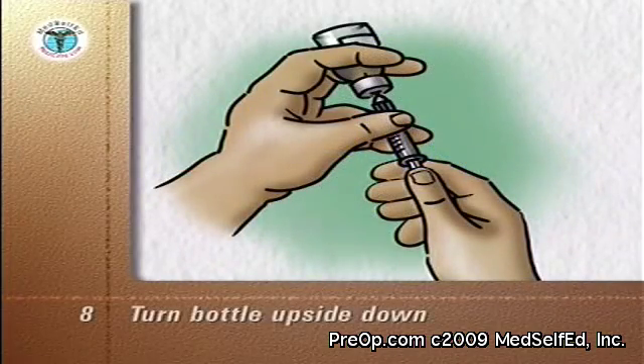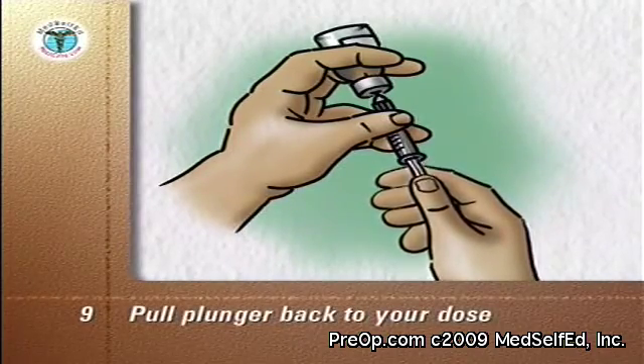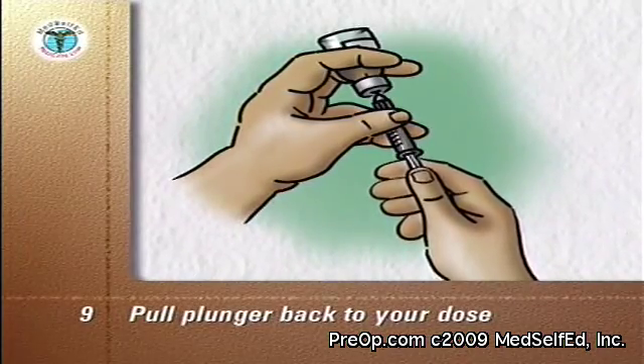Turn the bottle upside down so that the air in it is at the top. With the tip of the needle kept in the liquid, pull the plunger back to your dose. If any air bubbles are in the syringe, push the plunger back in and draw up the dose again.